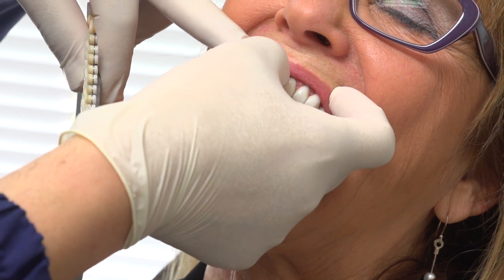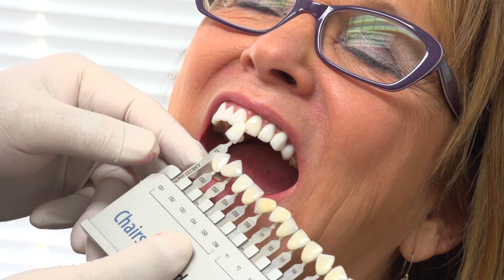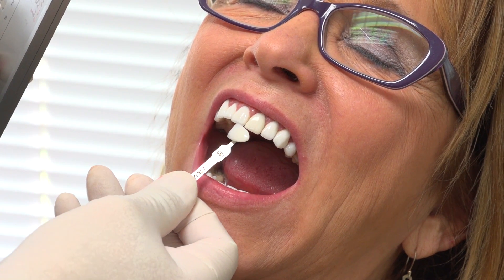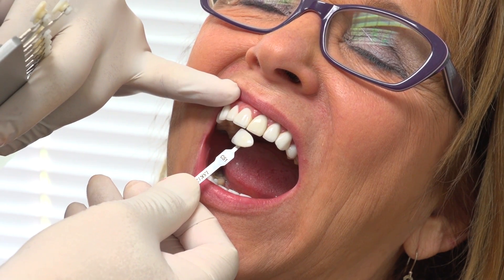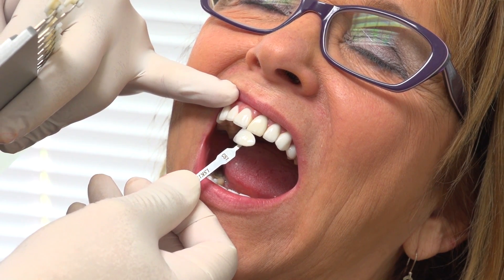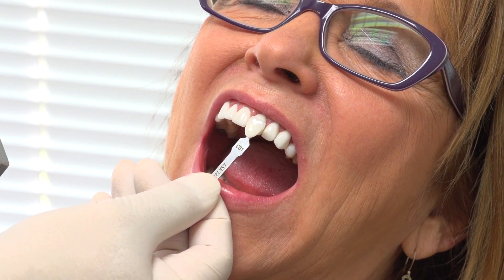I look at the other half portion, which is a really bleaching white. I match it, take it off, put it back, and basically see it as one. So with two portions of color I can create the final shade. I'm choosing CS1 for that portion.